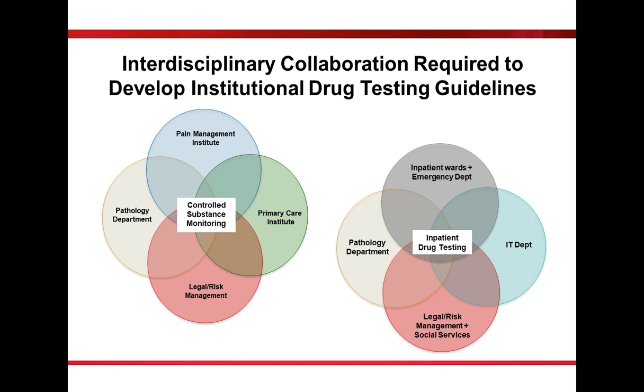All right, so our pathology department has worked very closely with a number of other specialties to create our institutional drug testing guidelines. None of these decisions were made unilaterally by the laboratory. We collaborated with the Pain Management Institute, with the Primary Care Institute, with our legal and risk management departments when we were defining our controlled substance monitoring guidelines. And when we were trying to figure out what panels and approaches needed to be used for inpatient drug testing, we had representation from several inpatient wards, our emergency department, IT to make sure things were flagging a certain way or being pulled from our EMRs, the legal, risk management, and social services departments.